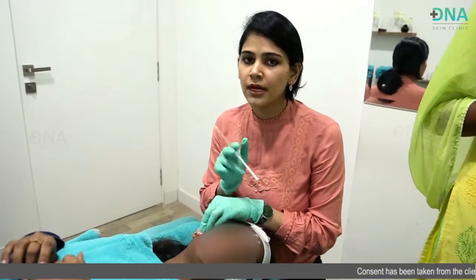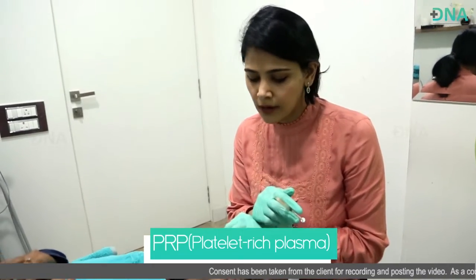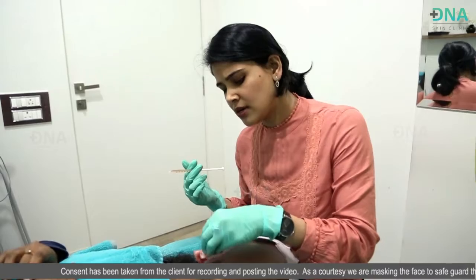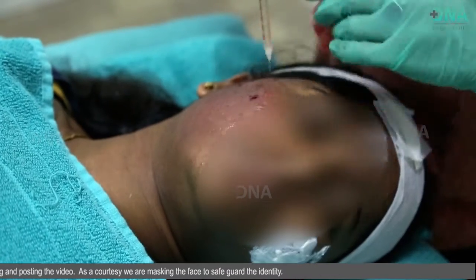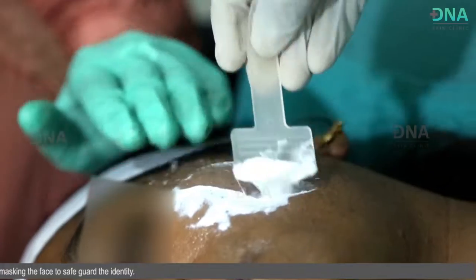Dermarolling can also be combined with PRP injections. PRP is platelet-rich plasma. We can also do without the injections, but I have found better results when I combine PRP with Dermarolling. Now let's move on to the other side.